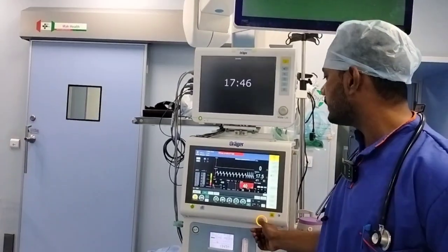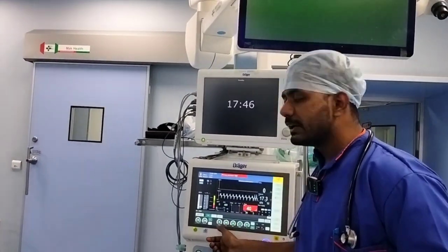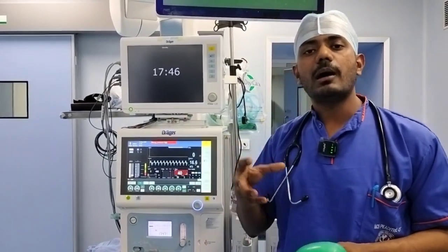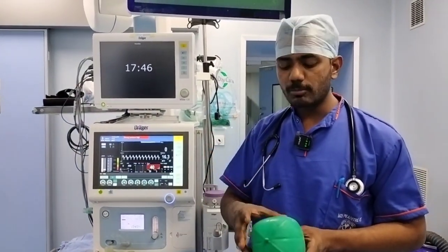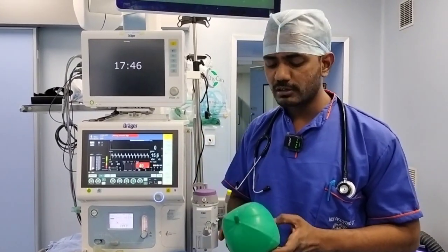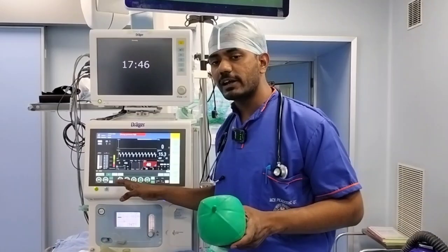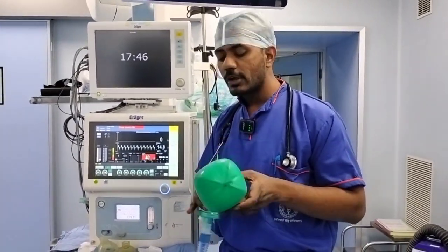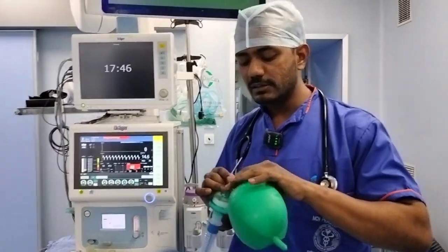The second thing is something called the tidal volume. When we take a breath like this, the amount of air that goes in and comes out is what we call the tidal volume, the volume of air which goes in and out. Here I have set it as 520 ml. That's what is expanding inside this bag, which we usually call the test lung.